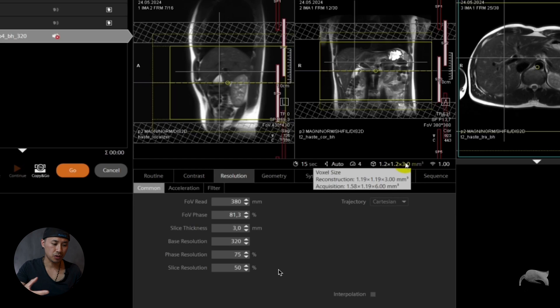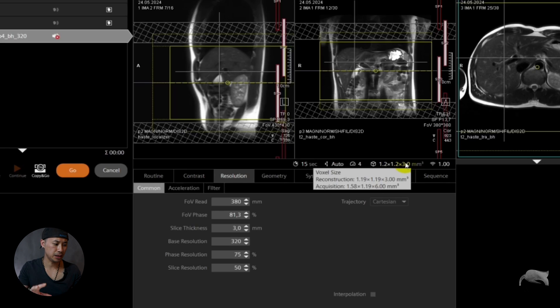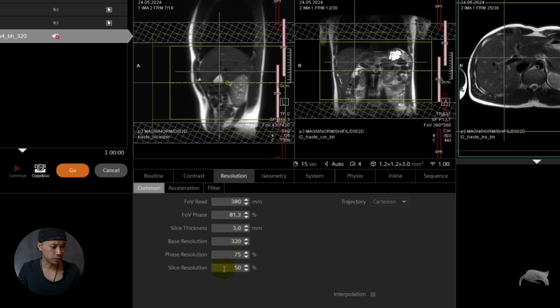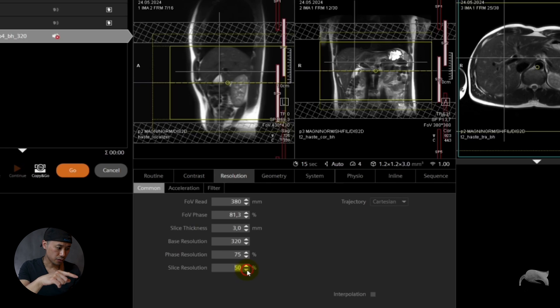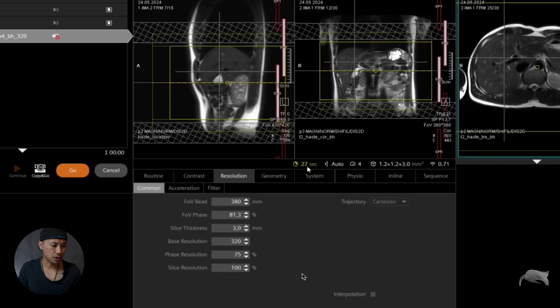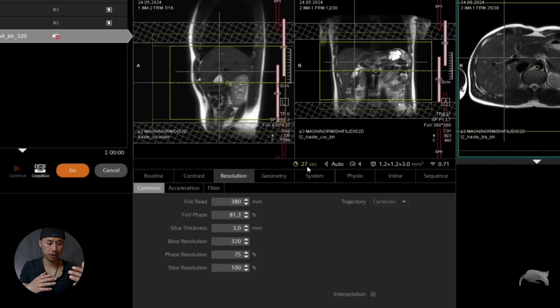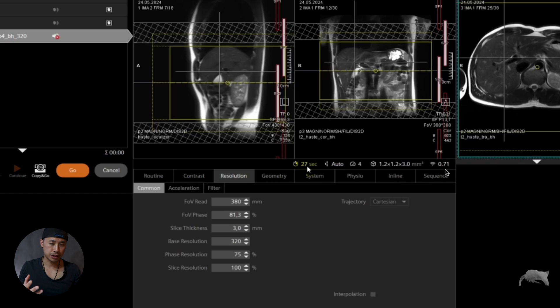How can we do a true 3 millimeter? Well if you want to do a true 3 millimeter you choose 100% here, then we go from 15 seconds, watch now... 27 seconds. So that's almost double, right?